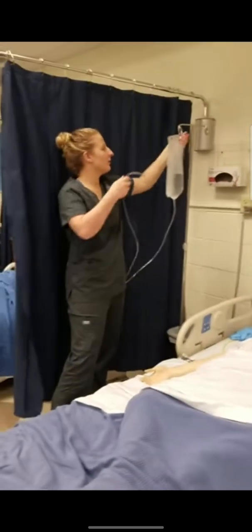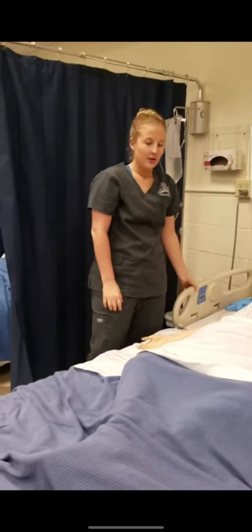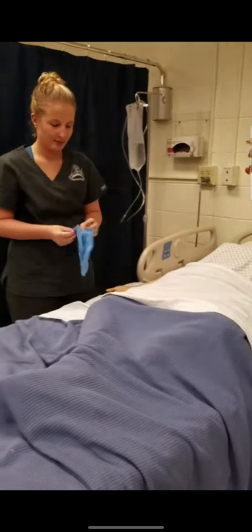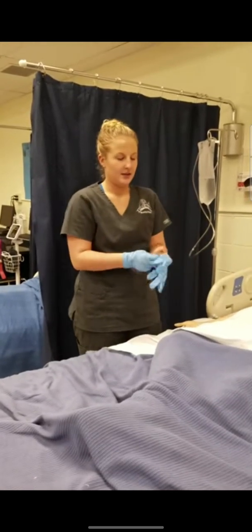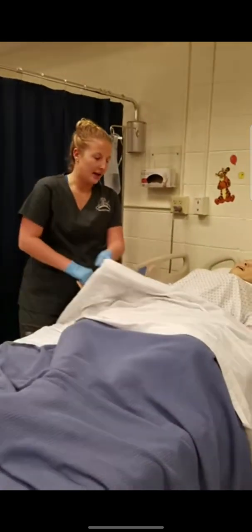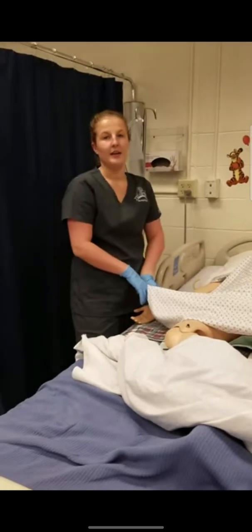I'm going to hang it on my IV pole. I'm going to introduce myself to my patient, check two patient identifiers and check my order. I will perform hand hygiene and place clean gloves on. I will assess my patient's abdomen for tenderness and see if it is distended. I will ask them when their last bowel movement was, the consistency, the color, and how much. I will make sure they have a pad underneath them in case anything leaks out. I will assess their mobility and see if they can get up to a bedside commode or if they need a bedpan.